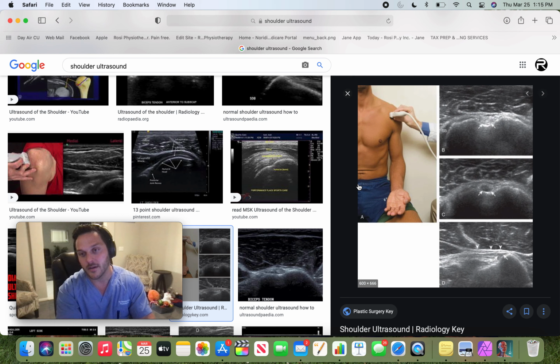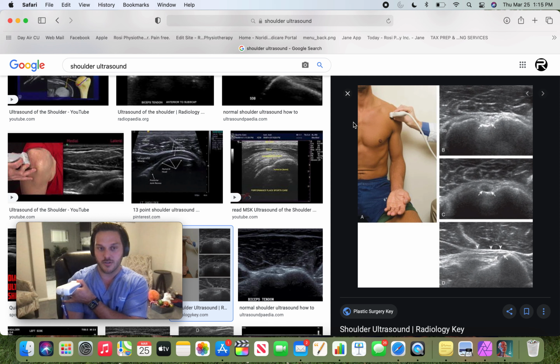So you may always be pointing right, you may always be pointing left, whichever way you do, that is technically the correct way to do it. Either way, that image would be just like the probe shows right here, that image is going to be just shown right here.